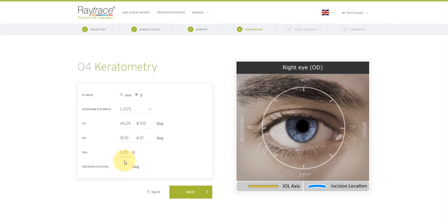And then we're going to indicate where I intend to make the primary incision. An incision close to the steep axis will reduce the cylinder required on the lens with 90 degrees. Now I click Next.